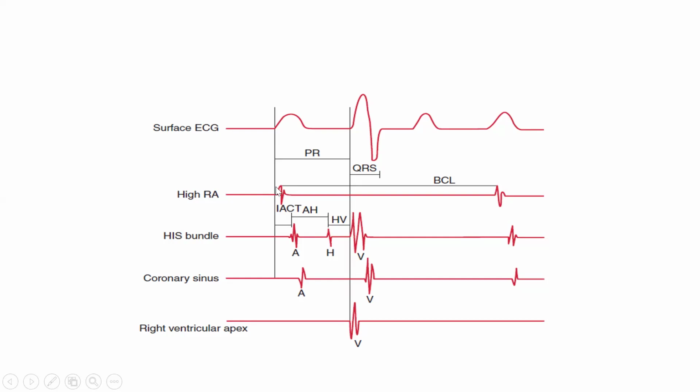So how do you use the HRA now to determine your heart rate, right? On the ECG or on the monitor, there's a caliper, right? All these things are calipers that they are using on the machine. So all I need is to put one caliper here and put the next caliper here, and it tells me the time interval. You get what I mean, sir? The same way we use the RR interval on surface ECG, we can also use the PP interval to determine heart rate if they are regular. Yes or no, sir?